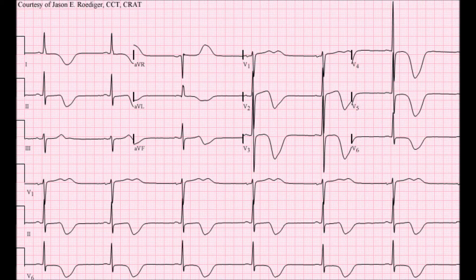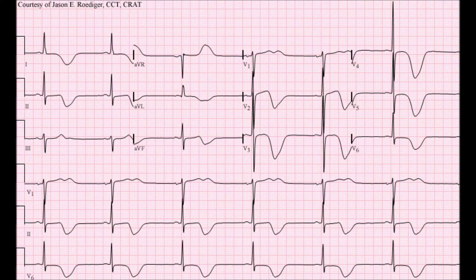You can also see that there are very broad inverted T waves, and that they are global — through all of the ECG leads. The T waves are discordant to the QRS complex. That is to say, if you look in AVR, that first appears to be a positive T wave; however, if you notice that the QRS complex is predominantly negative, you will see that the T wave is running opposite to it, so that qualifies as an inverted T wave.